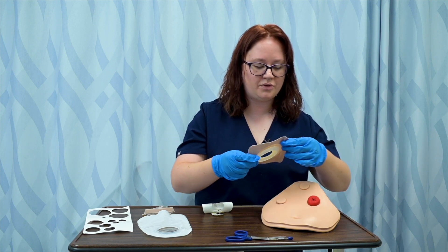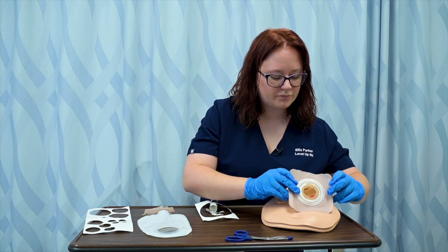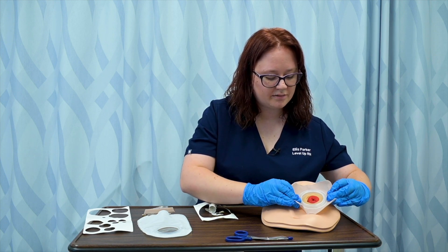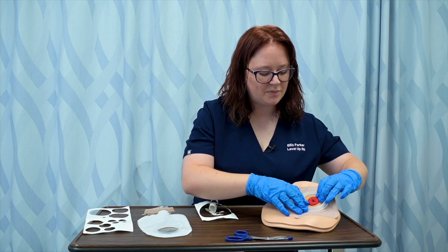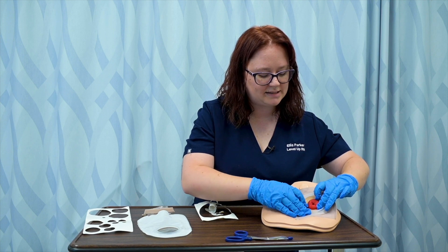So I'm going to remove all of the adhesive protectants on my wafer and place it around my stoma, pressing it so that it is firmly against the skin.